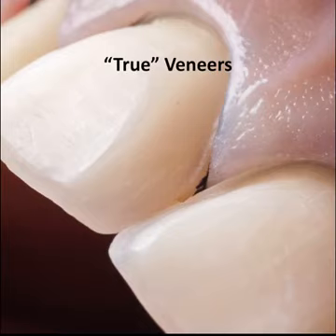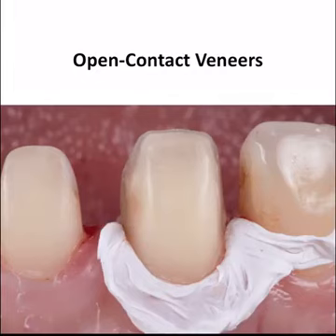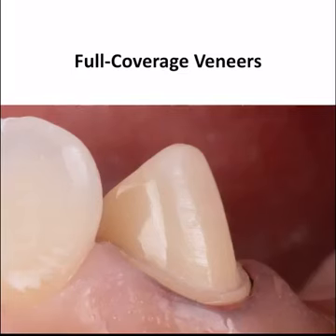The second type is a veneer with both incisal and proximal involvement. Now these types of veneers have two primary issues usually. One is that you invariably have to remove more dentin and more enamel. It's just unavoidable. The other issue is that the path of insertion sometimes needs to be more carefully considered, especially if you're doing multiple veneers at the same time. The third and the last type is a full coverage veneer, otherwise known as a crown. I tend to think of crowns as a last resort, for situations when veneers are not possible.